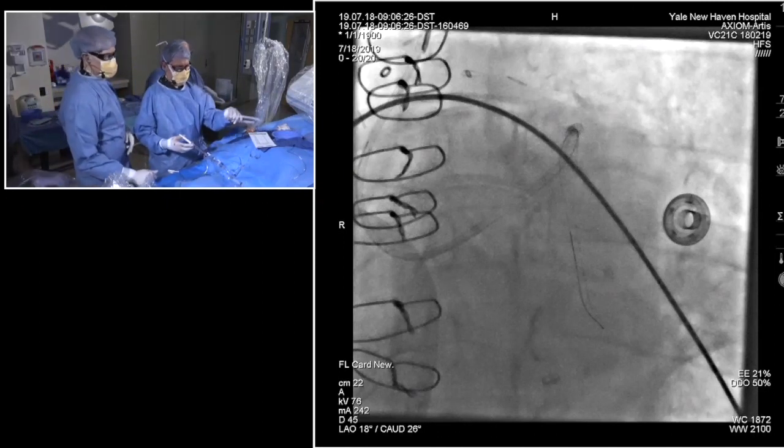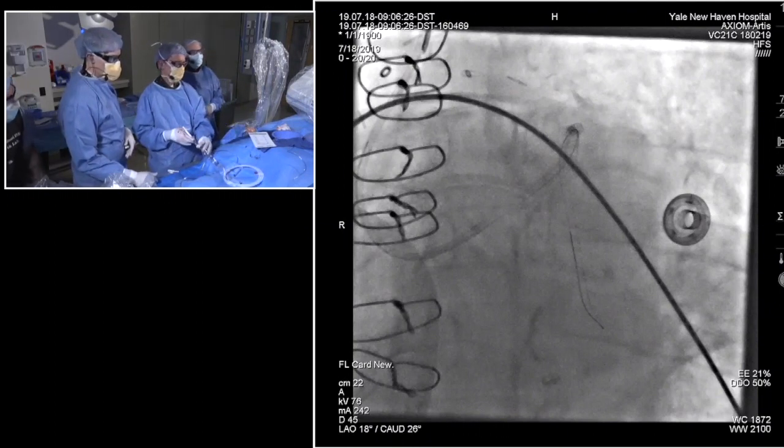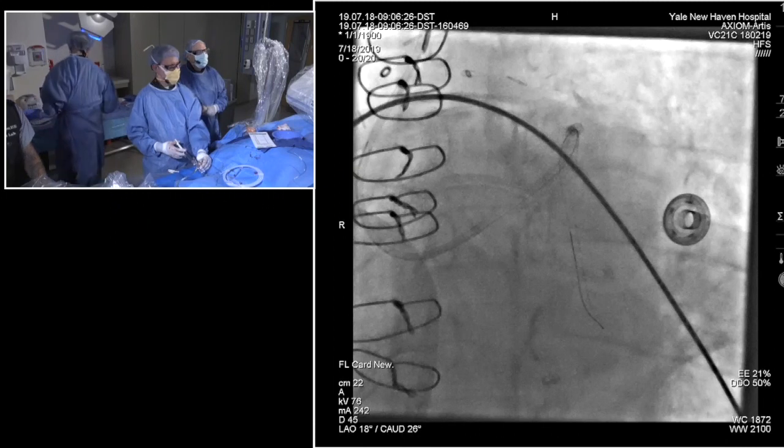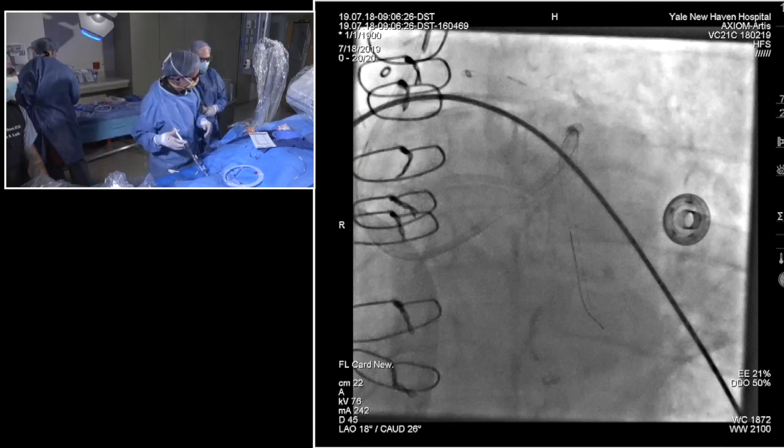Pressure's pretty good. No, we're good. We're off pressure. I would go by her. Yeah, I mean, she runs around 100. That's her. I would start coming down a little bit on that.